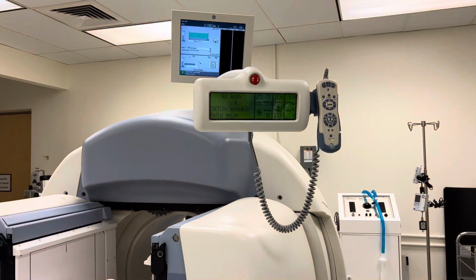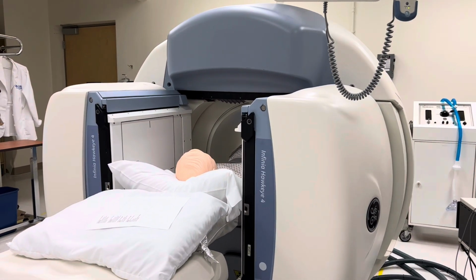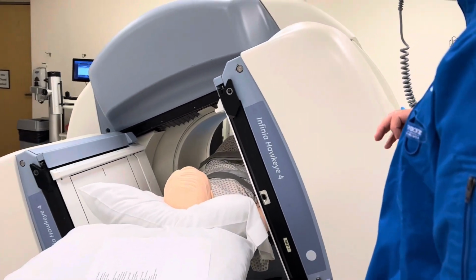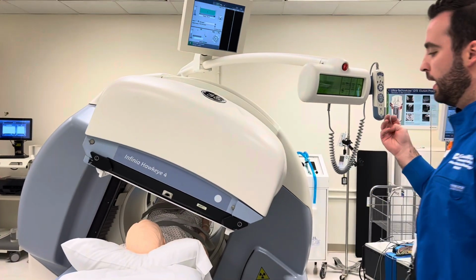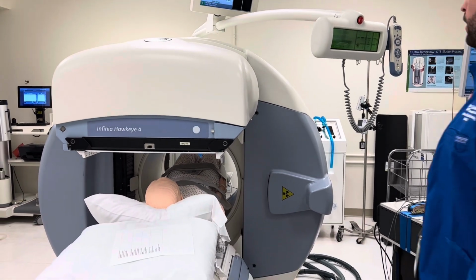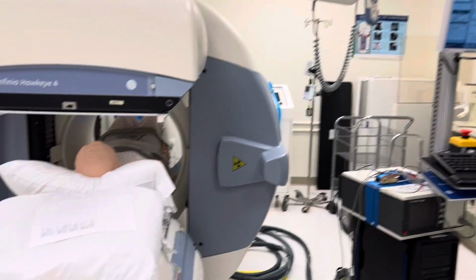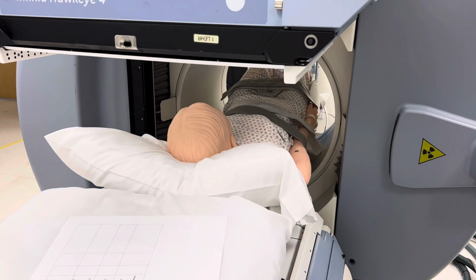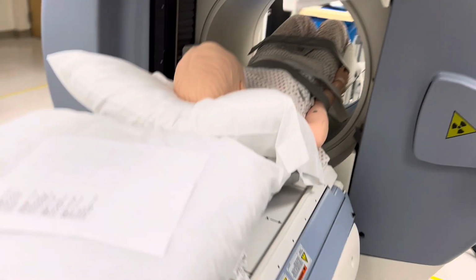So it's going to bring the detector heads out, and then it's going to rotate the detector heads for us. Okay, Rosie, the detectors are going to rotate. This will be really close to your head, and it'll come nice and close, but it will not touch you. Again, the camera is very quiet, it doesn't make any noise, and the pictures will take about 22 minutes. So again, for the whole bodies, the detectors do come close on their own because of the light bar. So it'll come close until anything breaks the plane of that light bar.